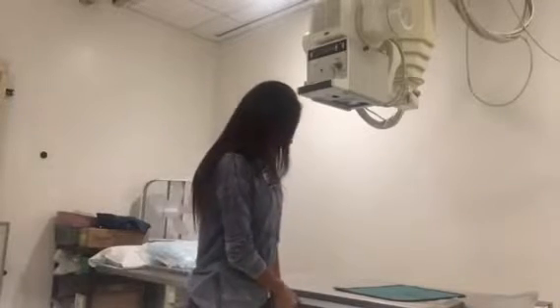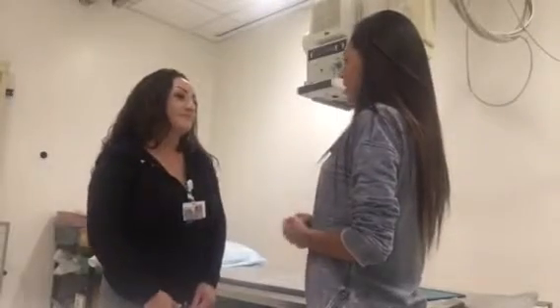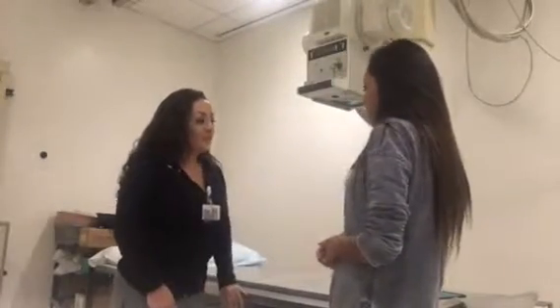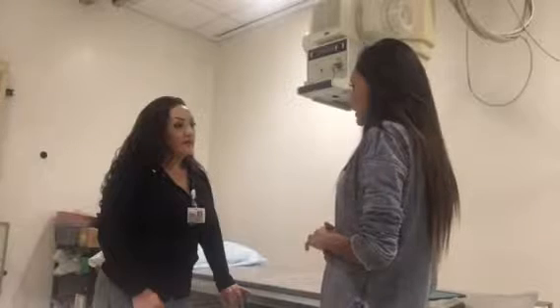So I'm going to go ahead and call my patient back. Montalvo. Hi, my name is Jay Hyde. I'm from the radiology department. We're going to be taking some x-rays of your knee. Can I get your full name and date of birth? Anne Marie Montalvo. Okay, and your date of birth? 5/15/80. And then what's going on today? Why are you having the x-rays done?